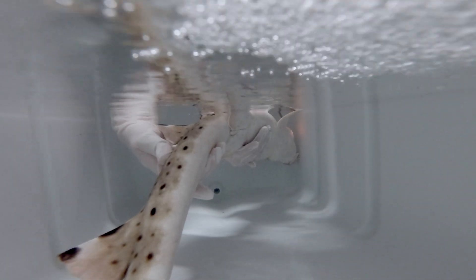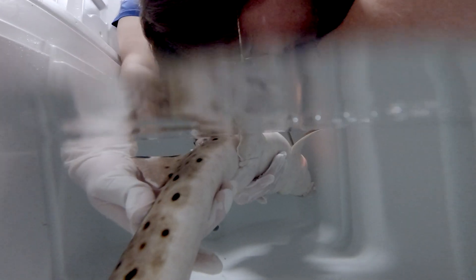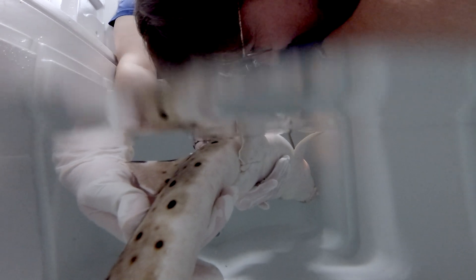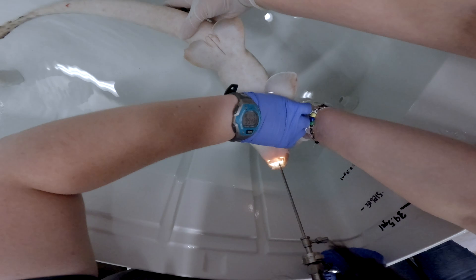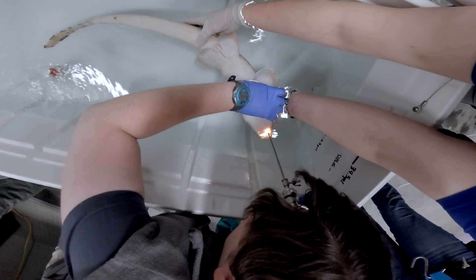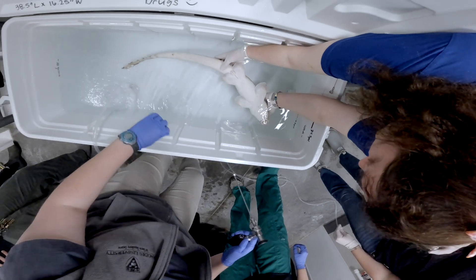After that, we want to get a good look at the shark's gills since those are really important to their respiratory system. To do that, we take a scope, which basically helps us see into very small spaces, and insert that through the gill slit so I can get a magnified view of what those gills look like. Once all of that looks good, we can then use that scope to see into the mouth, but we have to be careful that we don't scratch it on their teeth.